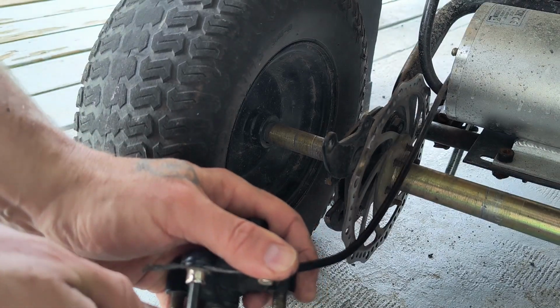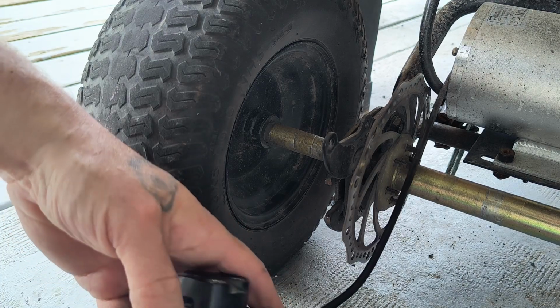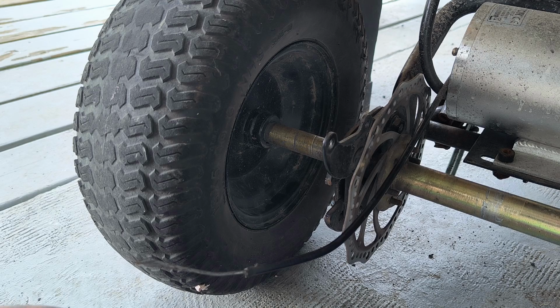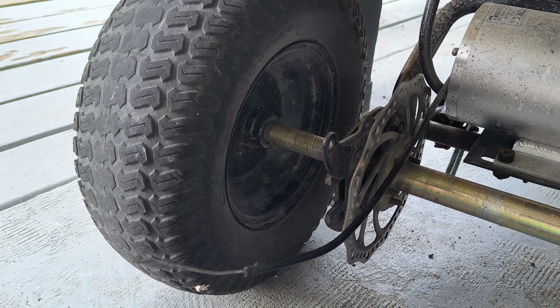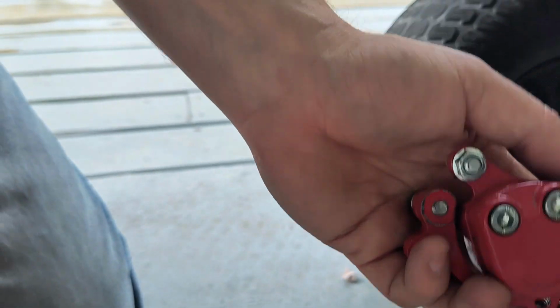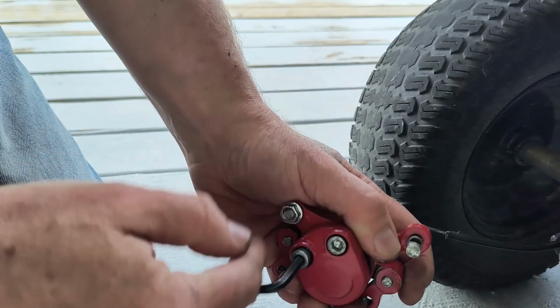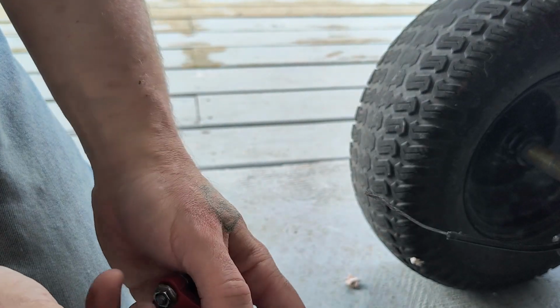Let's disconnect the cable. There we are. Let's see if we can't get this one on there. Well, see if we can get this one on there first. We're going to get the pads in there out of the other one. Well, first I'm going to see if that cable's going to fit through.